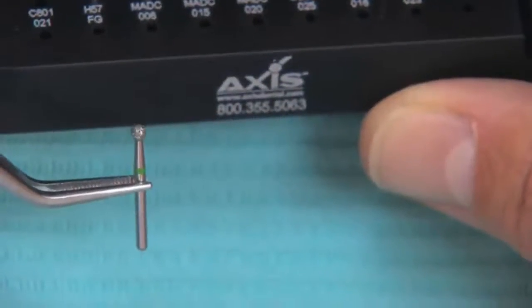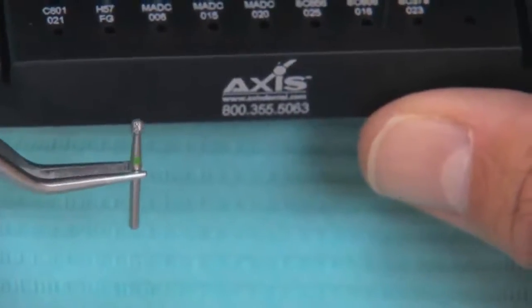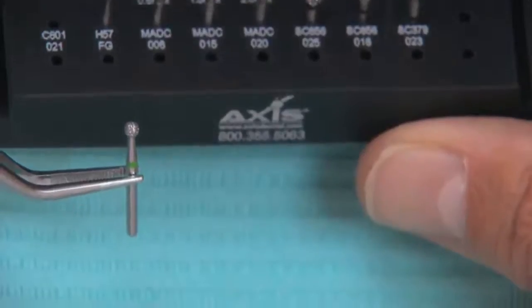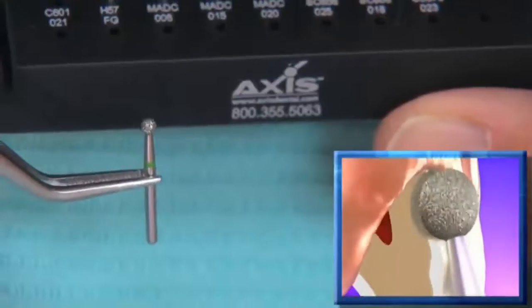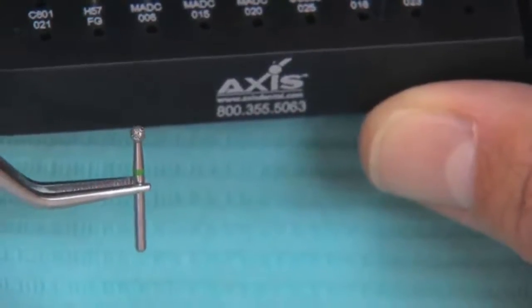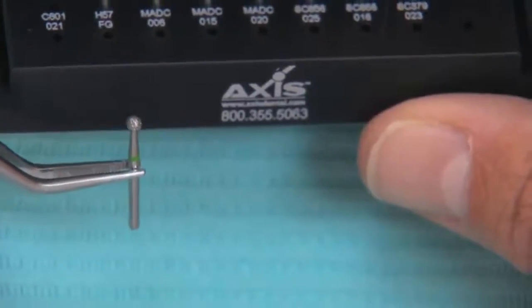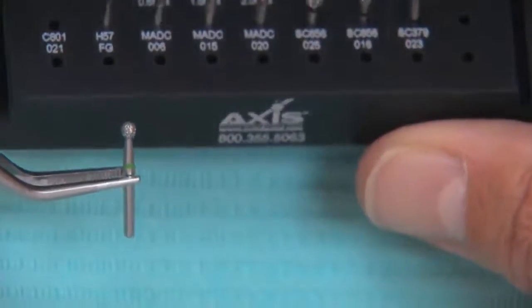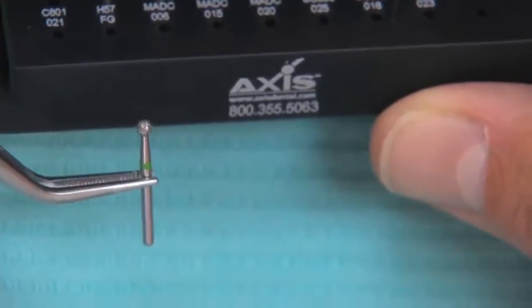The 801021 burr is probably the one you haven't used much before. It's a round diamond, used right after we break the contacts and place that first retraction cord, to actually prep the margin. When it's sunk to half of its depth, it's going to cut a perfect half circle in the gingival third of the tooth. That assures we have enough reduction in the gingival third and cuts our margin as a perfect half circle. When we do our axial reduction, we're left with a quarter circle — which is the shape of a perfect chamfer or shallow shoulder.